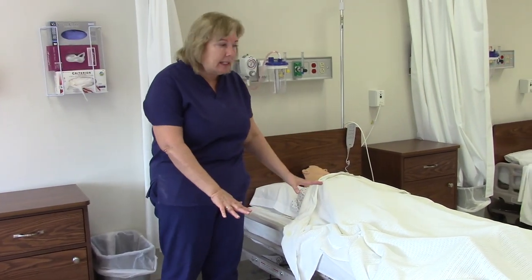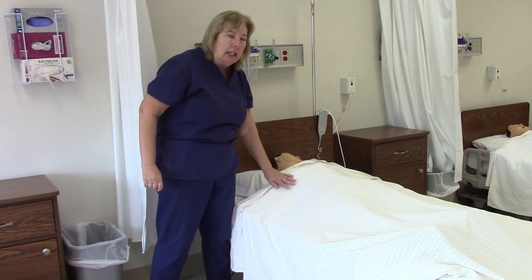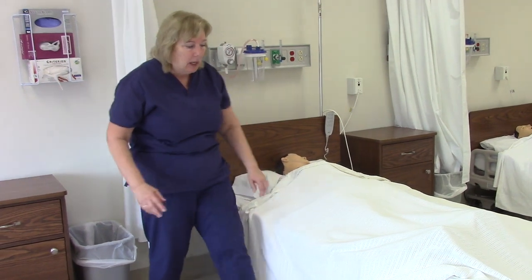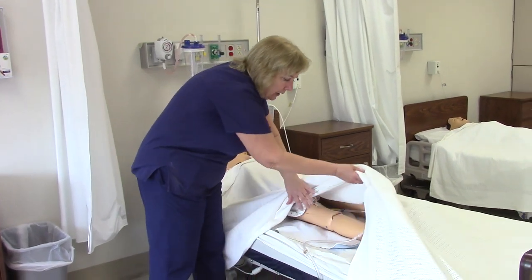I will now return back to the patient and make sure the patient is safe and doesn't need anything. I will briefly review again the Foley catheter tubing. Before I leave the patient's room, I make sure the bed is in the low position and the call light is within easy reach. I ask my patient how they are and if they need anything — the patient is fine and does not need anything at this point. I check out the tubing and it is all placed well.